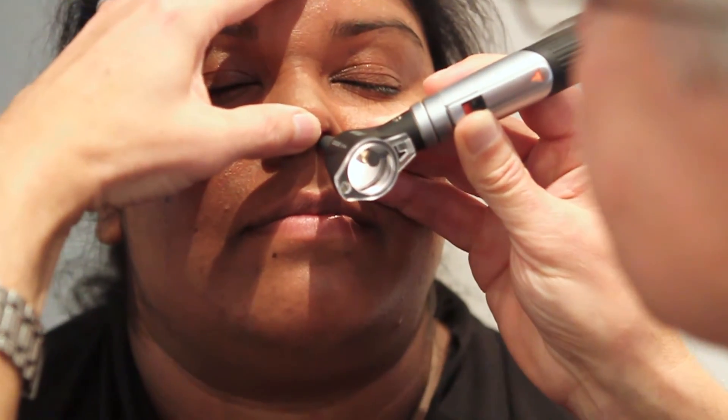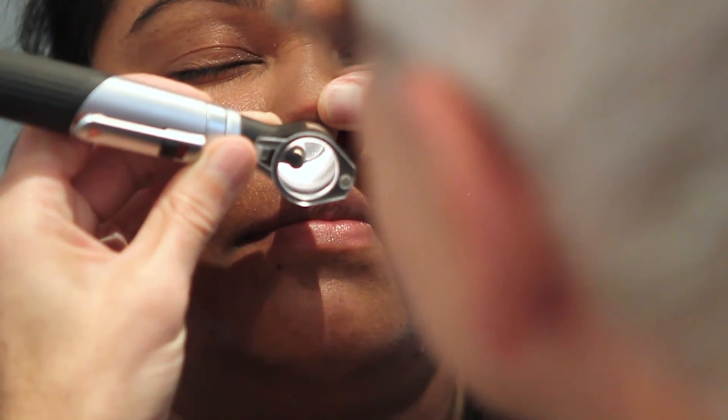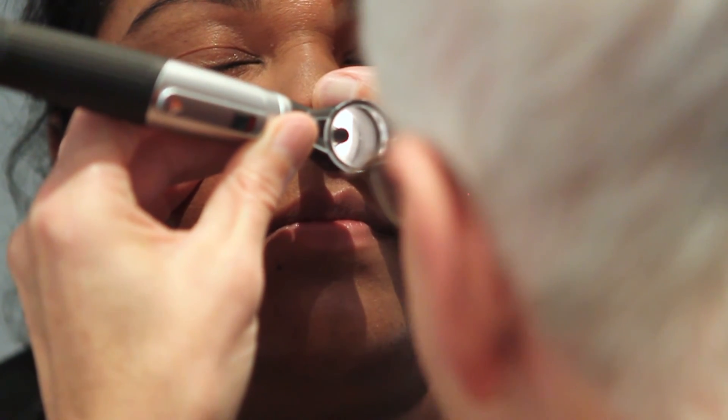Pushing up and then using an otoscope, just gently putting that inside and then looking all the way back, and then quickly swapping hands, pushing up, gently inserting it and then looking all the way back. That looks healthy. Thank you.